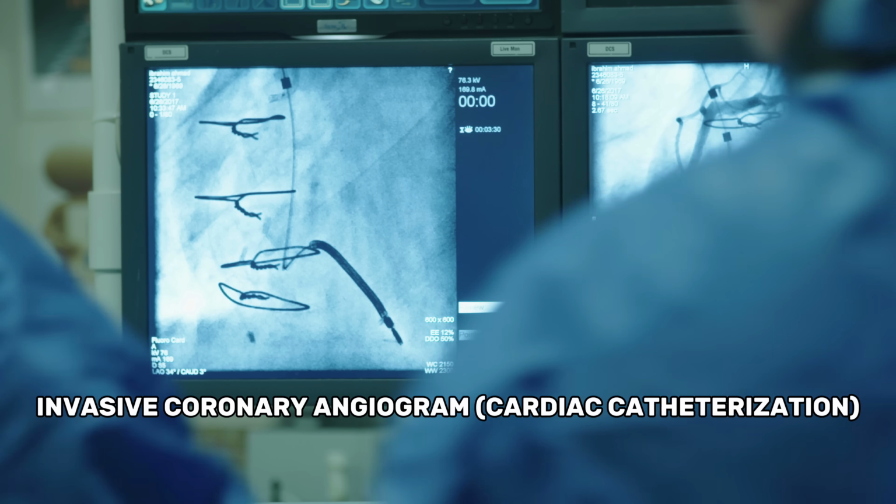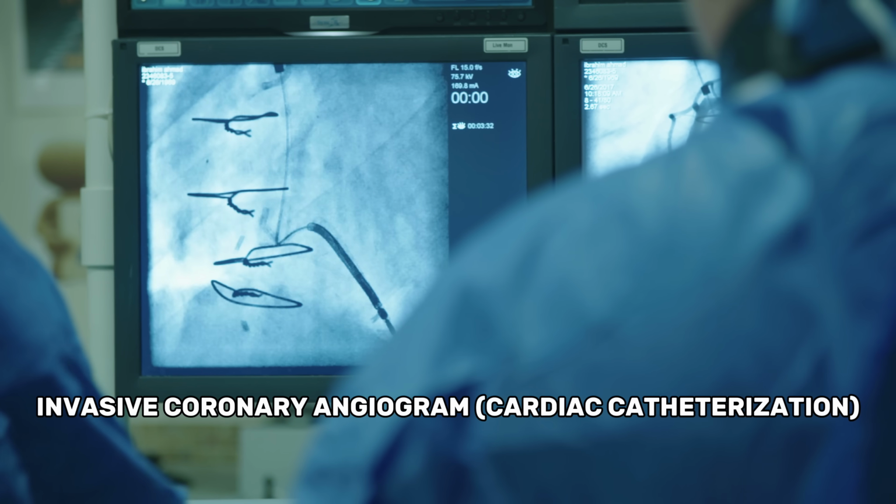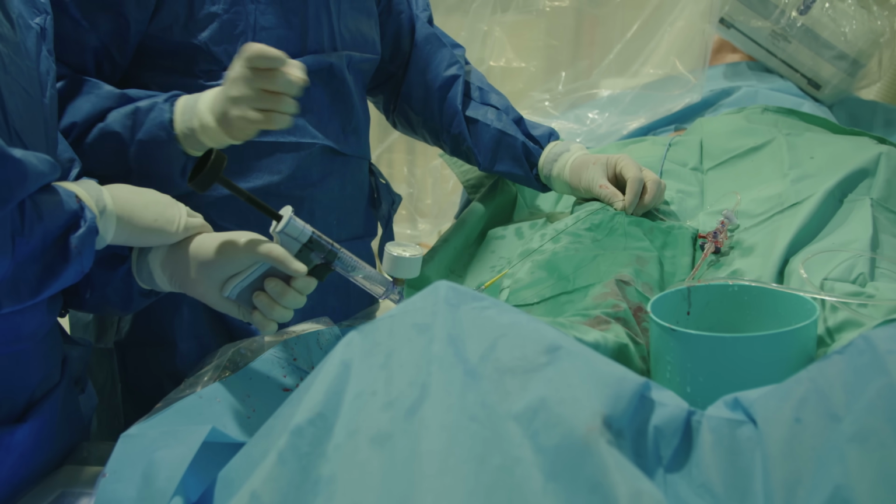Okay. And then the gold standard, the referee that's going to blow the whistle and say this puck's past the goal line, is the invasive coronary angiogram. And so most often when we do that, we put a small catheter through the radial artery in your wrist. In the old days, we used to go through the leg a lot.